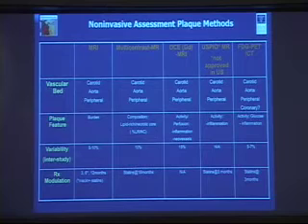That's very critical. Now an area that is common in oncology is the use of dynamic contrast-enhanced MRI. We've heard about MRA with gadolinium, but this is really using every possible data point and following the perfusion of that contrast within the tissue. Something we do actually in the heart, but it also has critical information that we can extract in the vasculature itself. We can get basically tissue perfusion.